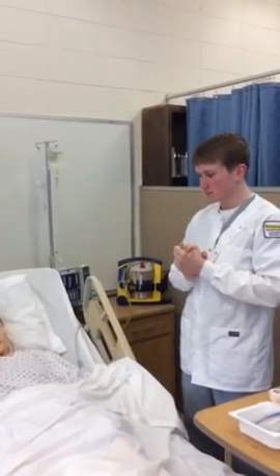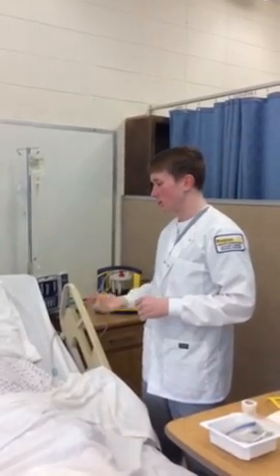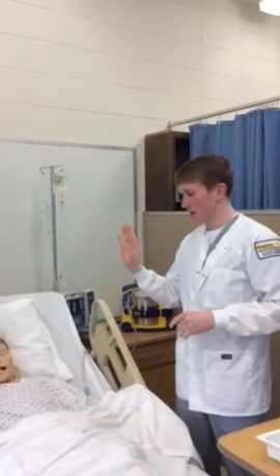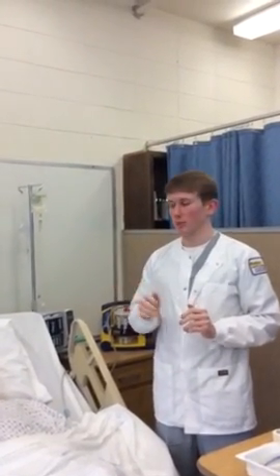And then establish a stop sign with the patient. So at any point during the procedure, when you feel like you need to stop, just raise your hand and give me the stop signal. And then I'll perform an abdominal assessment.